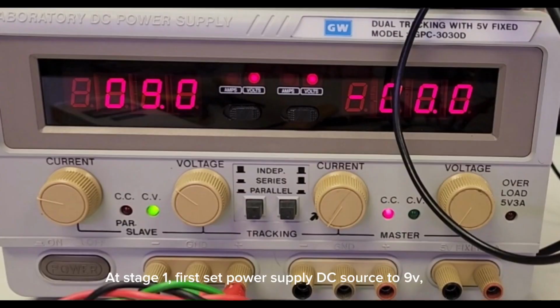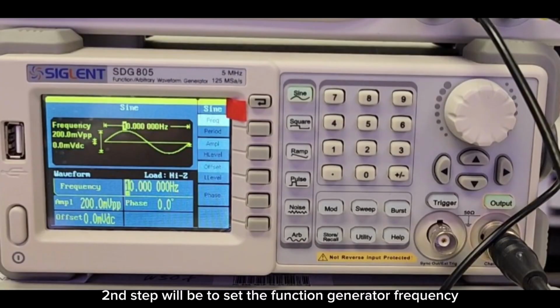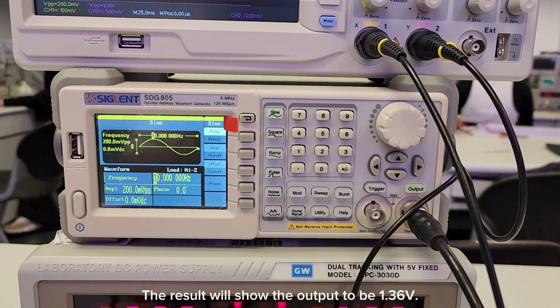At stage 1, first set the power supply DC source to 9 volts, and then connect the clips on the power supply to the circuit. Do not connect the green clip. The second step will be to set the function generator to a sine wave at 10 Hz, 200 mV peak to peak. The result will show the output to be 1.36 volts.